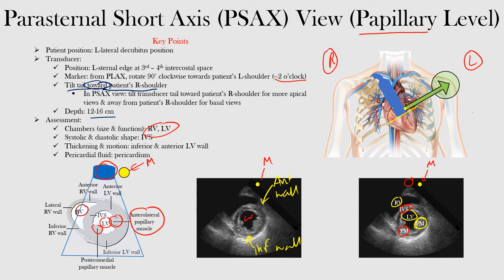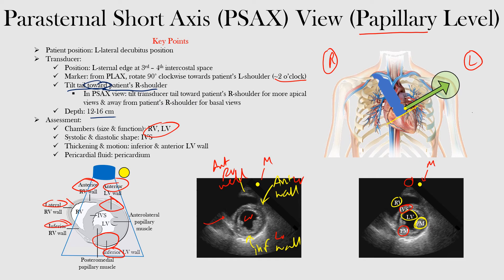The inferior wall is this portion here, and then the anterior wall is that there — so that's the anterior wall of the left ventricle. We can also see somewhat of the anterior right ventricle wall, which is this one here — anterior RV wall, which is that portion. You can see the lateral sometimes, which would be here, not really so much in this image. And then you may see the inferior RV wall down here.